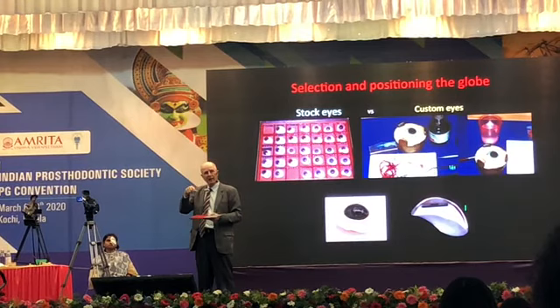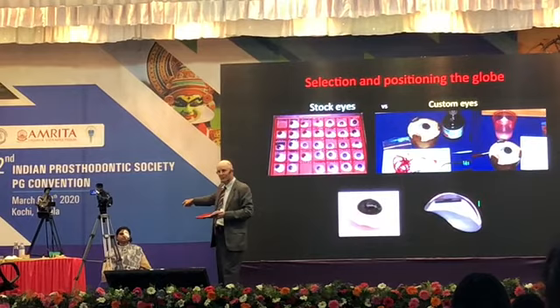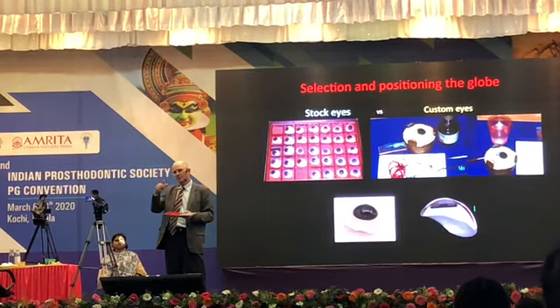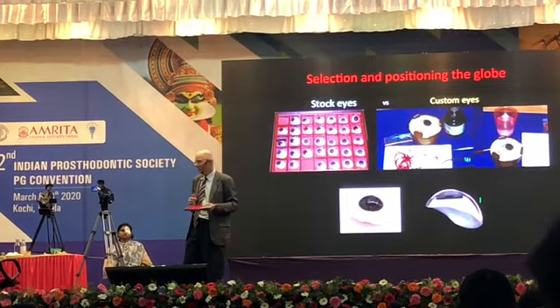And that's exactly what happened with this patient. We picked out a globe, and the globe's too small. So when we try to sculpt and develop the scleral show, the white of your eye that shows, particularly in the lateral aspect, it doesn't show enough. So we don't have a globe here that fits this patient, unfortunately.